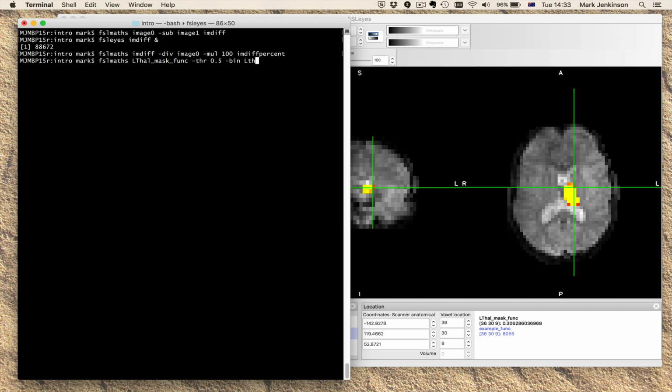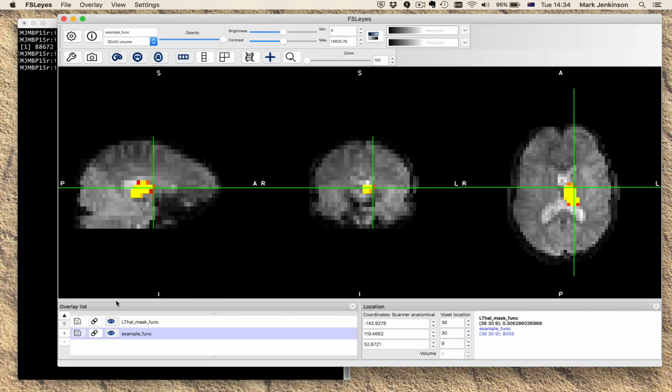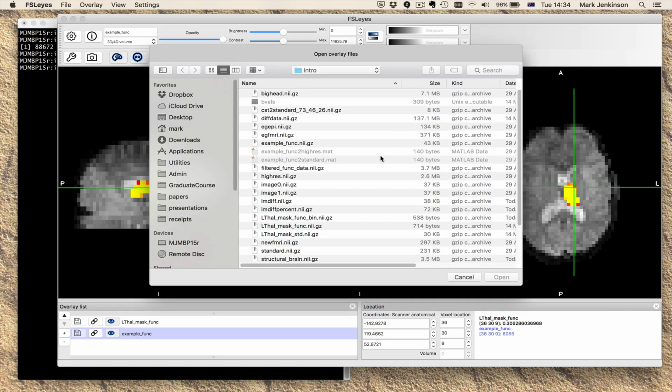And then after that we're just going to save out our result with a new name. So I'm just going to put bin at the end. So often when you see bin, it'll mean binarized rather than throw in the rubbish. Okay, so now that's run, let's actually load that result.